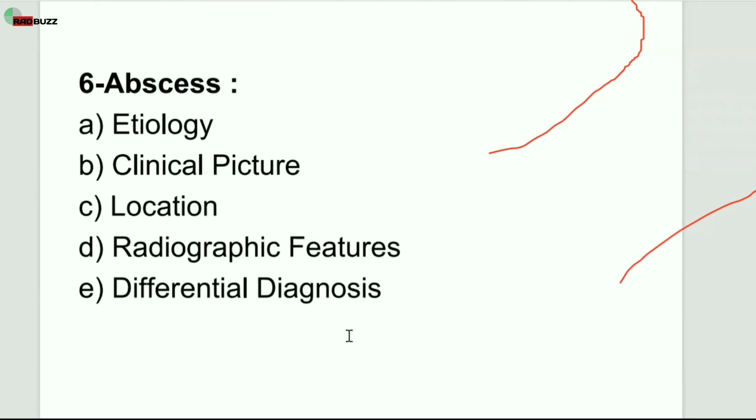If there's cavitation, think of pulmonary TB, given the history of previous TB. In miliary tuberculosis, there will be a miliary pattern spread, in both primary and reactivation. The main thing you need is to differentiate between various infections and metastases, which may or may not calcify. History obviously is important before reporting.